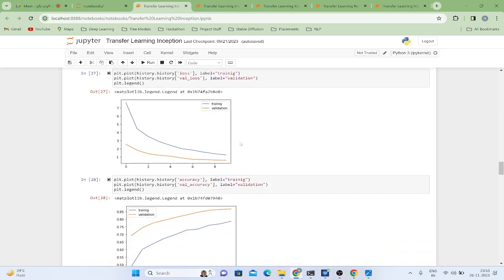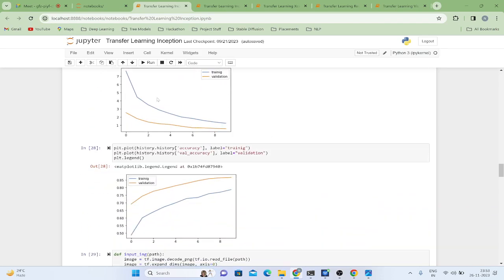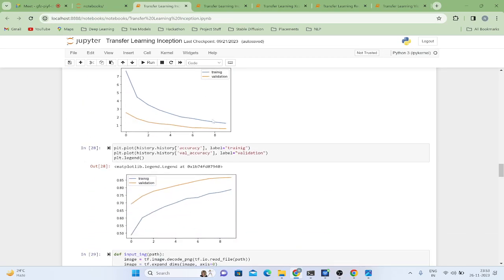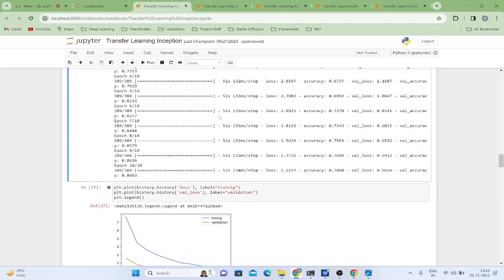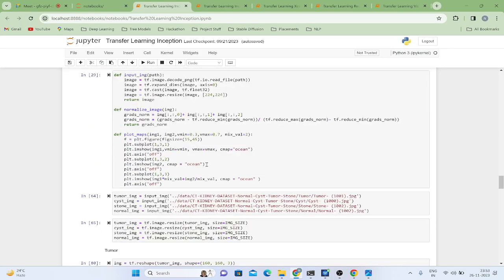We trained it for 10 epochs, and we can see that the loss curves are going pretty well. There's not much variation in them, so we know it's training well. We can also see the average validation accuracy is 86, which is pretty decent. It is not a bad accuracy. If we consider this as a normal machine learning or deep learning project, and we see 86, we would say this is a great one, we can go ahead and use it.